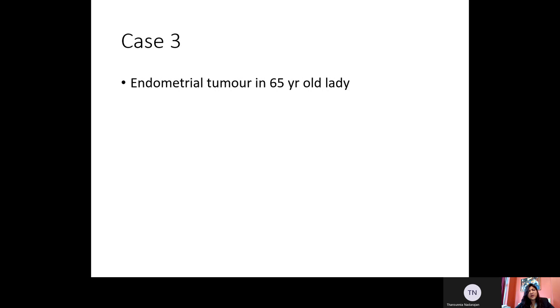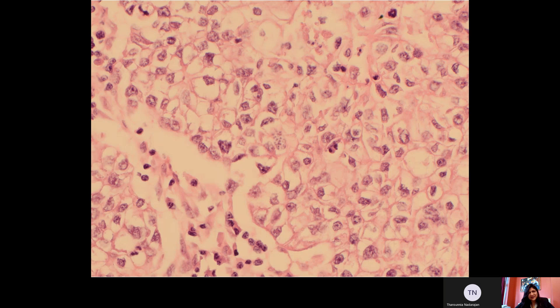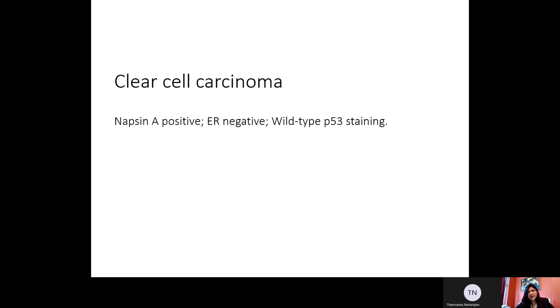Our third case is an endometrial tumor in a 65-year-old lady. This is a very straightforward case of clear cell carcinoma. We can see sheets of tumor cells which are polygonal in shape with clear cytoplasm and high-grade nuclei. They are pleomorphic with many showing nucleoli. We did Napsin A on this, which was positive. It will be ER negative with wild-type P53 staining, if you are thinking of other differentials.